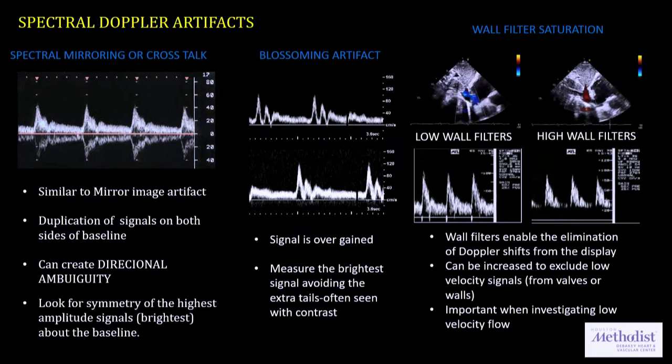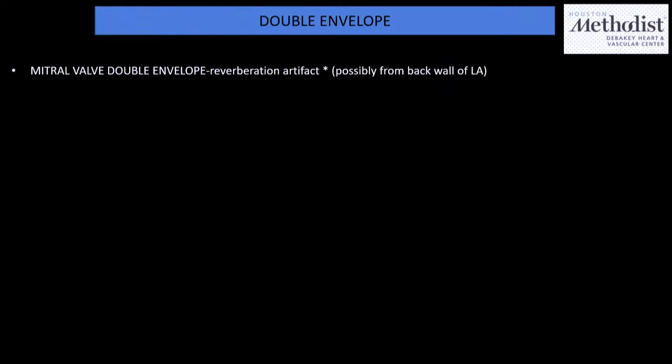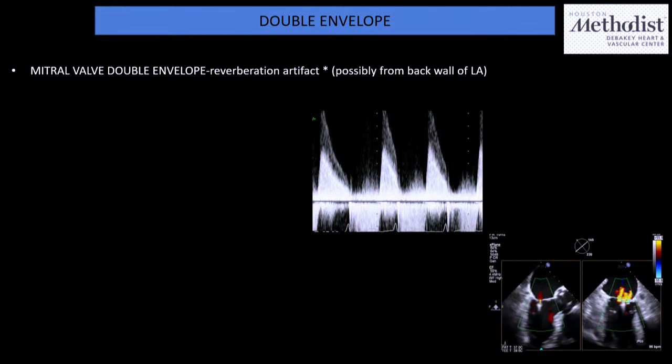And this one here, how many of you know about wall filter saturation? I'm sure all the sonographers know about it. It's very important to know, because when you're really trying to sample those low-velocity flows and you want to eliminate those unwanted signals, you probably want to change your wall filters. I'm sure all of us can relate, and some of us even more so.